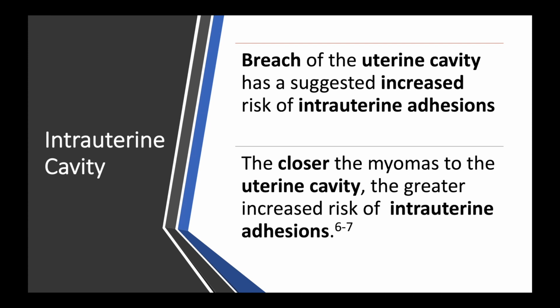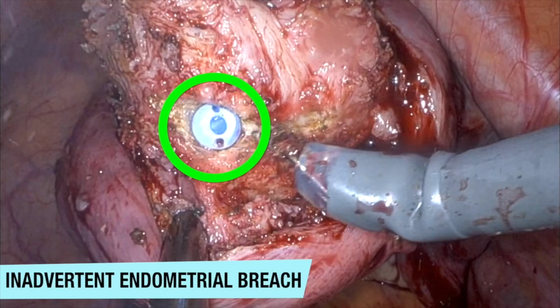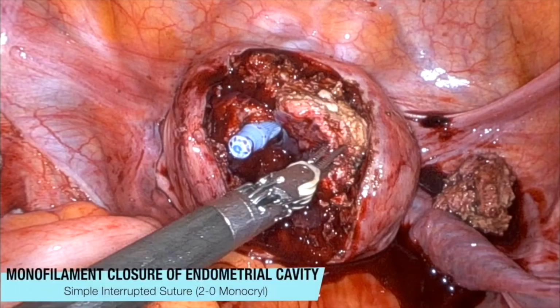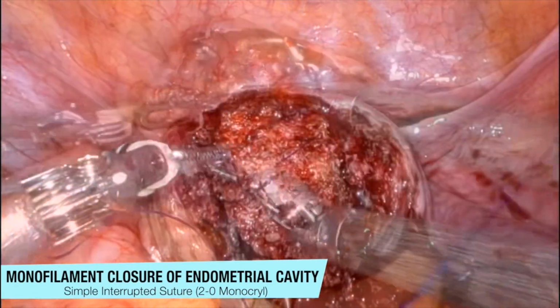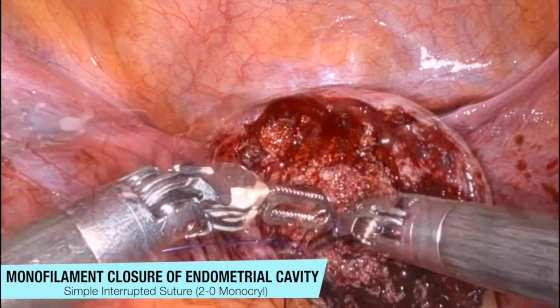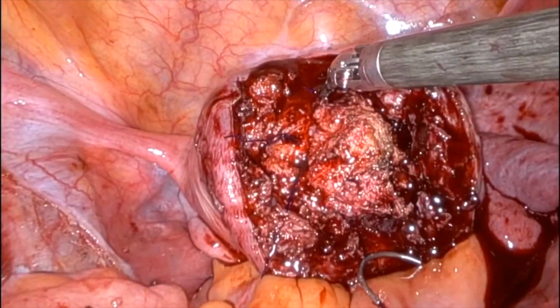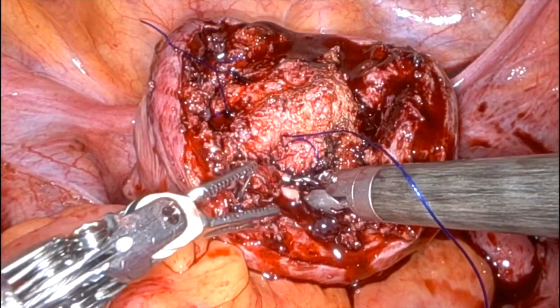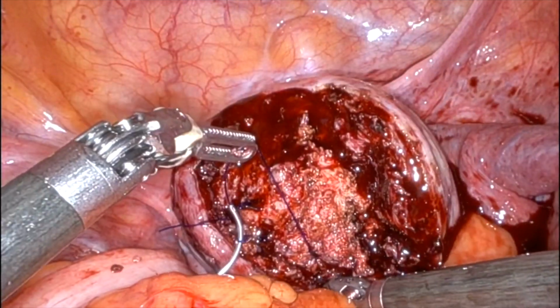Prevention of intraoperative involvement of the endometrium is desired to minimize the risk of intrauterine adhesions, which can impact future fertility. This intraoperative footage demonstrates inadvertent entry into the endometrial cavity and its subsequent repair using 2-0 Monocryl non-barbed suture in a simple interrupted manner. The benefits of endometrial reapproximation need to be weighed against the risks of increasing intrauterine scar tissue when assessing if endometrial closure should be performed, on a case-by-case basis, especially if the patient desires future fertility.